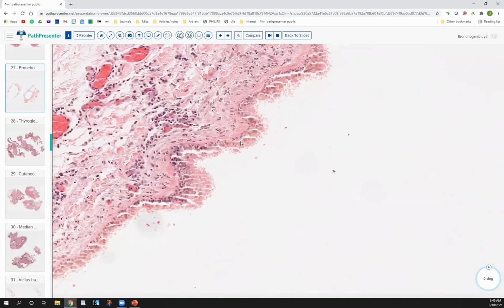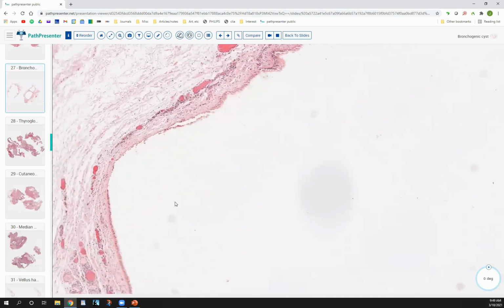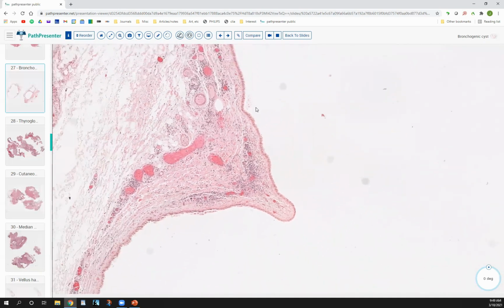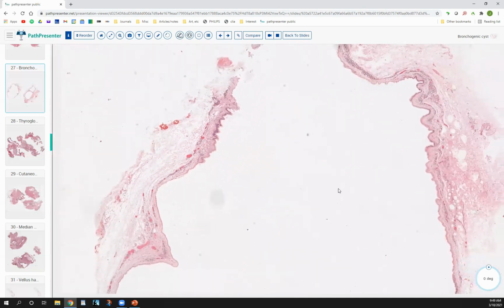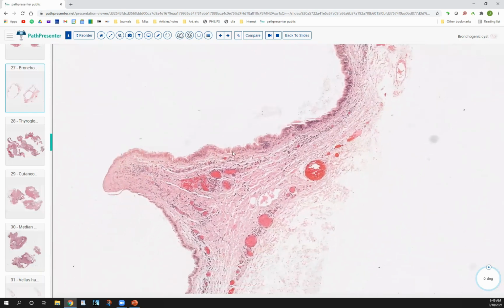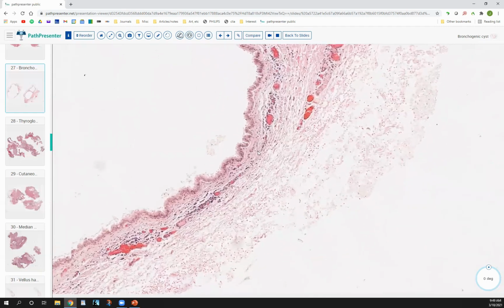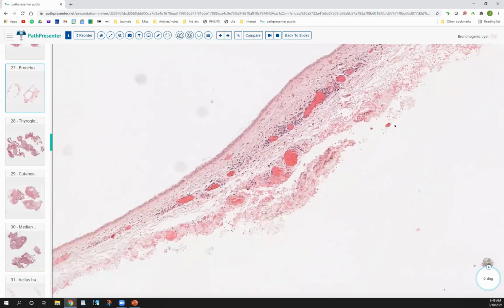If you do surg path, you become pretty good at this, but we don't see this too much in derm path: pseudostratified columnar epithelium. And in some cases you can even get goblet cells, which I may have to search around to find here. And you also see one other thing. You'll see a little bit of smooth muscle in the wall. So by now, you may have guessed it. This is bronchogenic cyst. We don't see it very often. Sternal notch is the classic location for it. And as I was saying, you get that pseudostratified epithelium. Sometimes you get goblet cells thrown in there, which I still haven't found a good one. But even without the goblet cells, I think we have our diagnosis. Smooth muscle or mucus glands can sometimes be present within the wall as well.